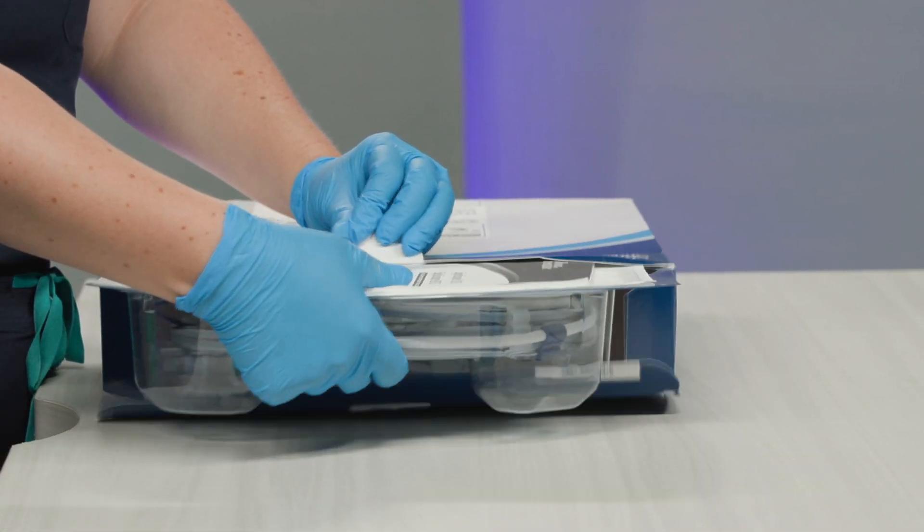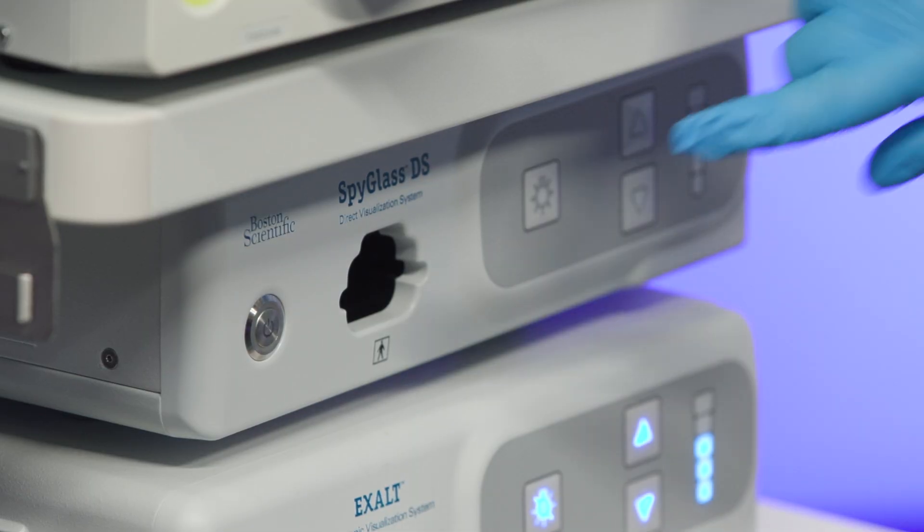Open the package and take the SPI Scope out of the box. Power on the controller.